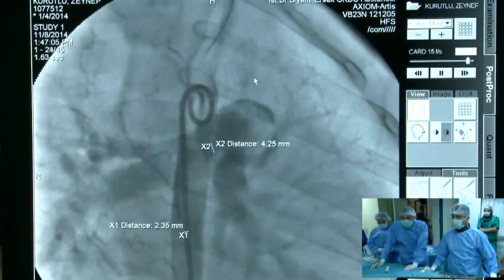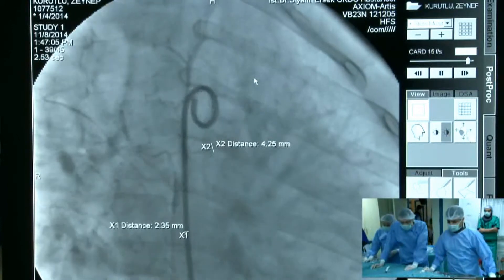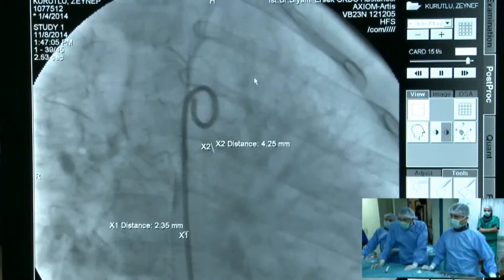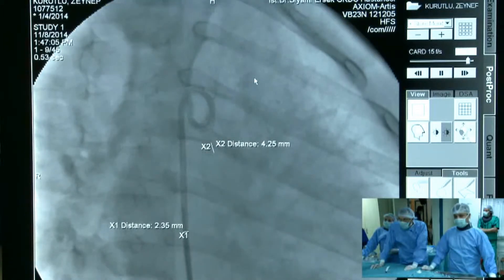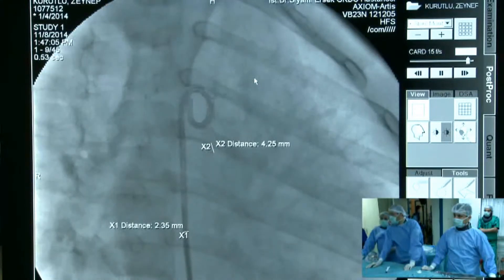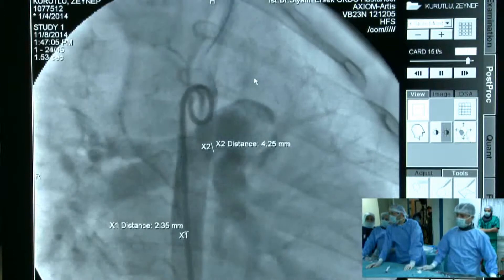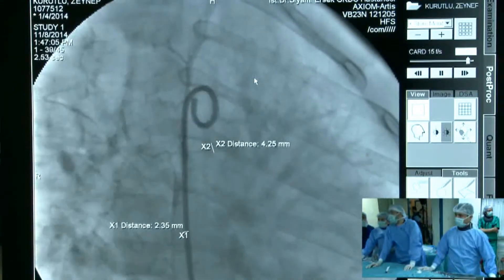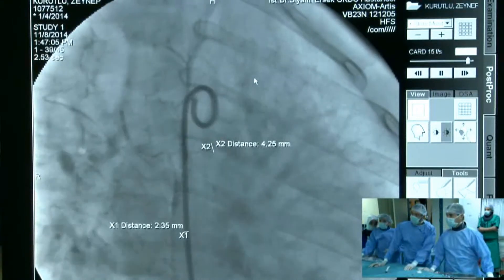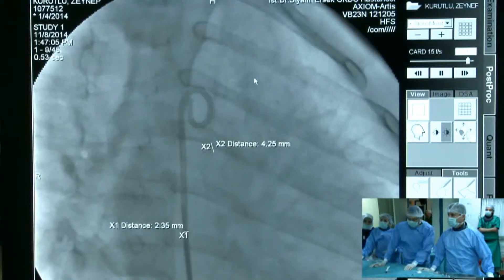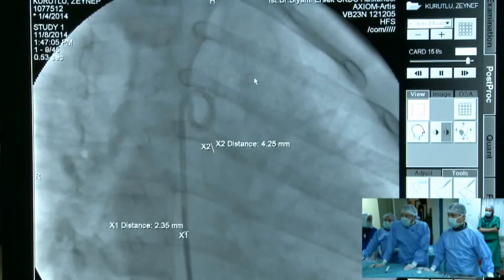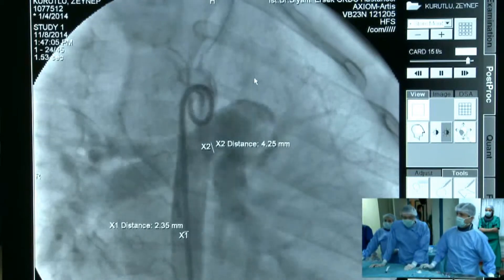I personally would not accept this RAO angle as a basis for decision making because it is not far enough in RAO. You should go to roughly 40 degrees RAO — that gives much better information about the length and ampulla of the ductus at the entrance to the aorta, and answers whether there is a risk of the aortic rim protruding into the aortic lumen. With the sheath in, a short contrast injection in 35 to 40 degrees RAO from the aortic side would be ideal.